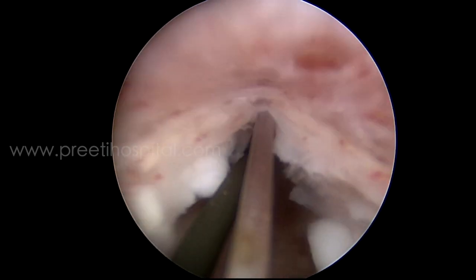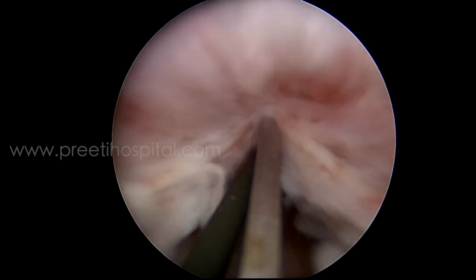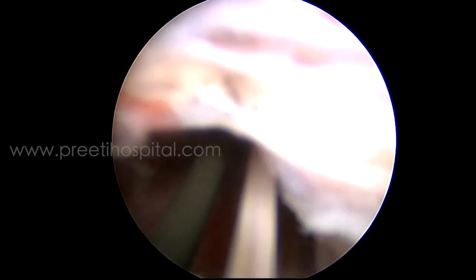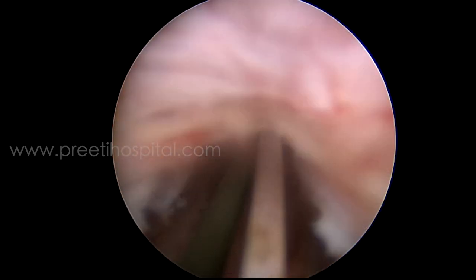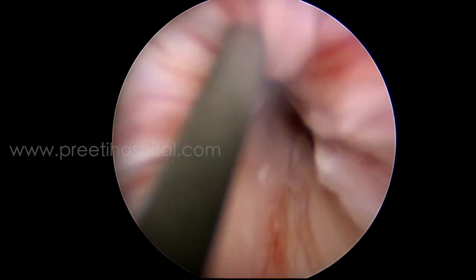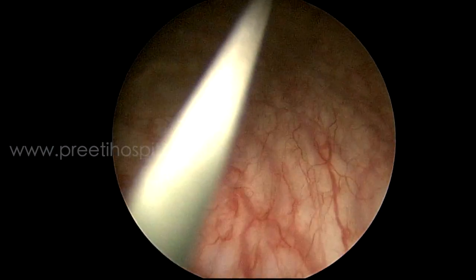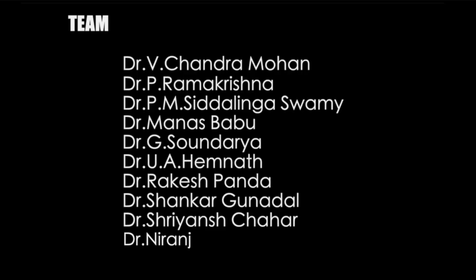A simple guide wire passage in a long stricture with multiple beads and a previous history of OIUs or dilatations is very, very important. The bladder is already full, so we have to work very fast — or else put a needle suprapubically and empty it, so that the pressure in the bladder does not rise, as it can sometimes cause severe septicemia.